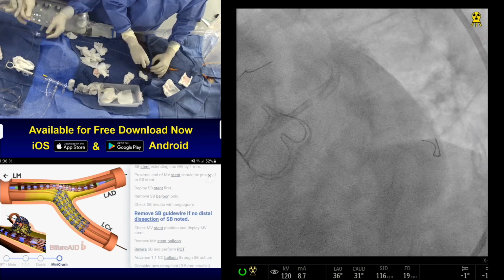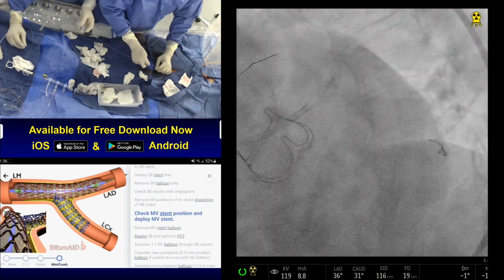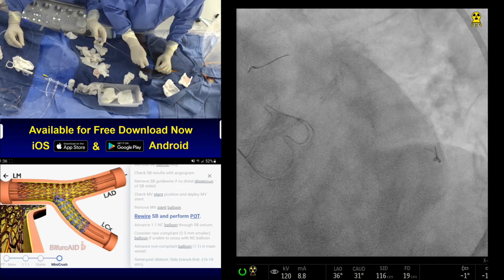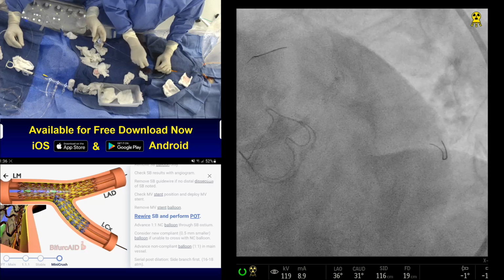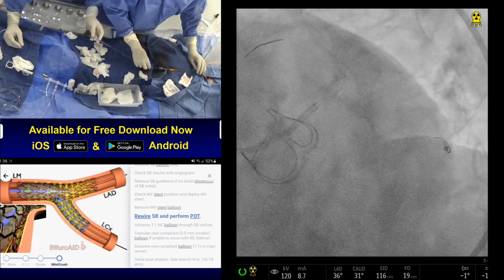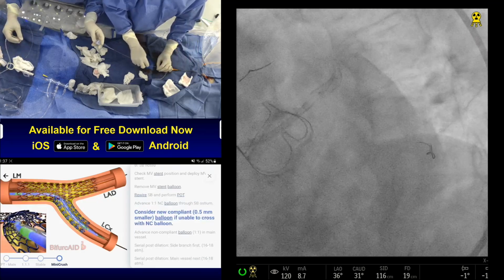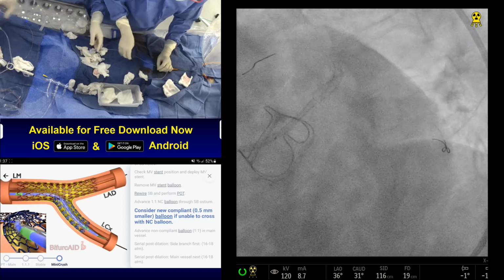Good. There's other teaching also, you can recross some other cell, but now we are with the compliant balloon, should go. Not going either 2.0. I can try to anchor. Negotiate the anchor catheter. Yeah. Yep. See there? Let's do the anchor. Okay. Yeah, leave it there.